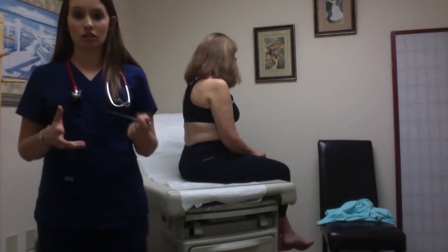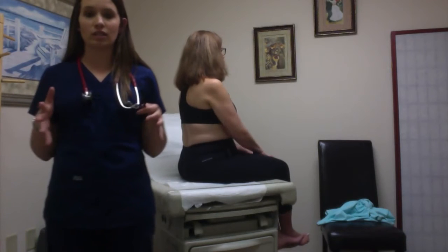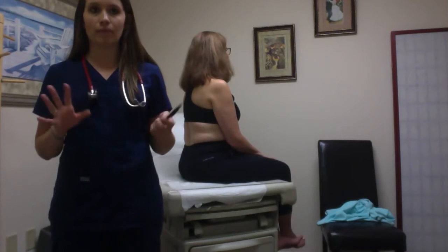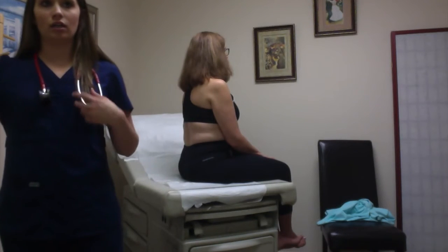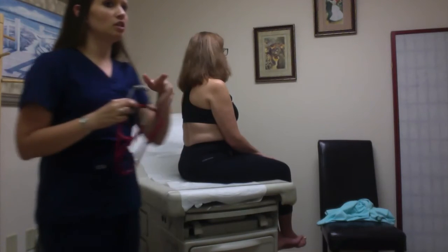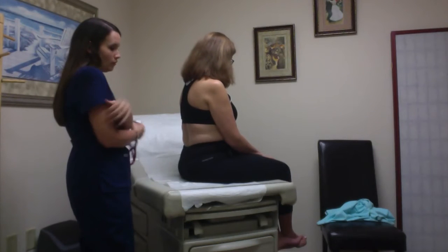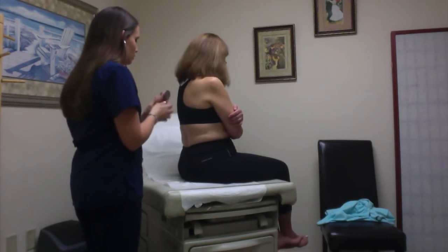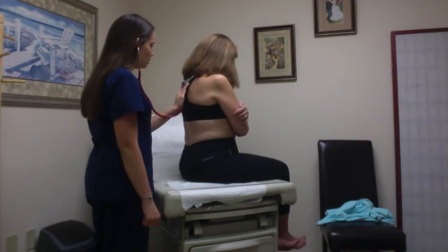Next, I'm going to auscultate the lungs. I'm listening for any adventitious breath sounds, crackles, wheezing, rhonchi, anything out of the ordinary. So I'm going to auscultate from side to side. I'm going to get you to breathe through your mouth. This just allows me to be able to hear it better. And I'm going to ask you to give yourself a hug. That'll open up your chest. Okay, deep breath for me. Exhale.